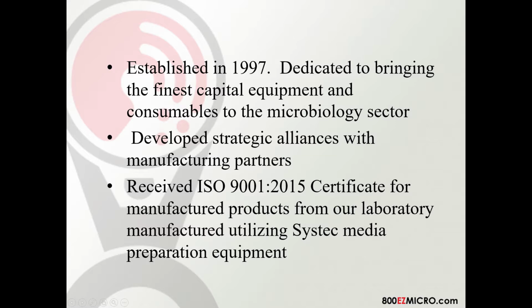throughout North America. This media preparation equipment is also very central to our operation for the consumable products that we manufacture here at our facility. We received our ISO certificate in the previous years for the media goods that we offer and sell throughout North America. And again, we utilize all of the Systec media preparation equipment that you will be seeing in the demonstration today in order to manufacture all of those products.